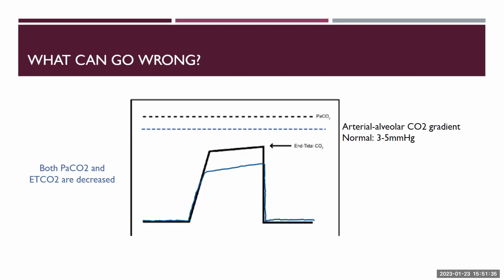That's why, let's say the patient is intubated and you don't want to get frequent blood gases, you can have the EtCO2 on and then correlate it with your blood gas and say, all right, I'm seeing a PCO2 of 35 and an EtCO2 of 35. So they're correlating, and if by tomorrow they're still the same, there's no reason to recheck it just to confirm the PCO2. There might be other reasons, but for that, I'm going to just rely on EtCO2 telling me that the patient is blowing off enough CO2. Make sense? Courtney, are there any other conditions that you wanted to point out?